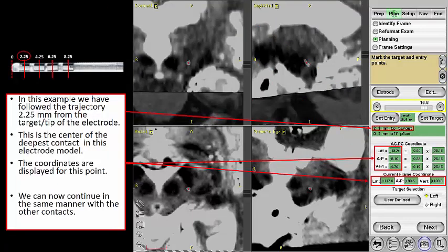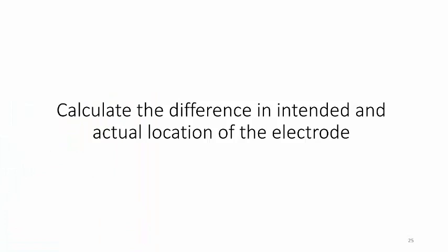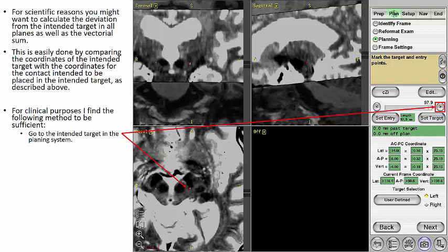In this example, we have followed the trajectory 2.25 mm from the tip of the electrode. This is the center of the deepest contact in this electrode model. The coordinates are here displayed for this point. We can now continue in the same manner with the other contacts. We can now also calculate the difference in intended and actual location of the electrode.